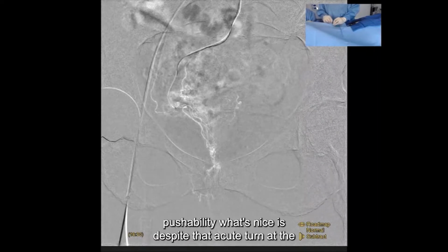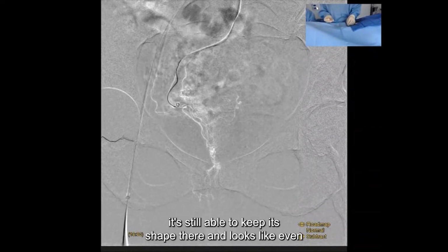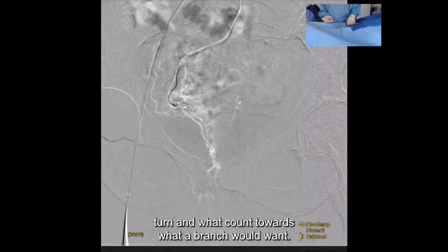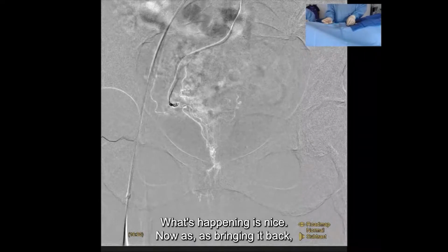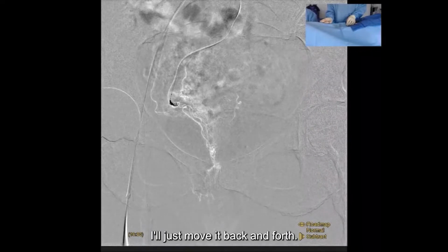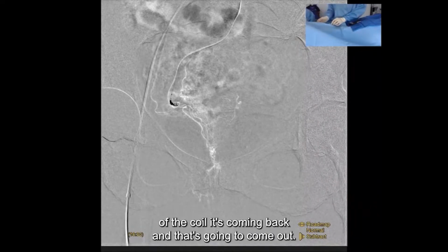So here with that pushability, what's nice is despite that acute turn at the IMA, it's still able to keep its shape there. There it goes. Look at that. And it looks like even the coil wants to take that preferential turn down towards the branch we wanted. What's nice now is as we bring it back, it's packing really well. Nice and soft. So you can see the retractor. I'll just move it back and forth. You can see that little dark spot is the retraction portion of the coil. It's coming back, and that's going to come out.